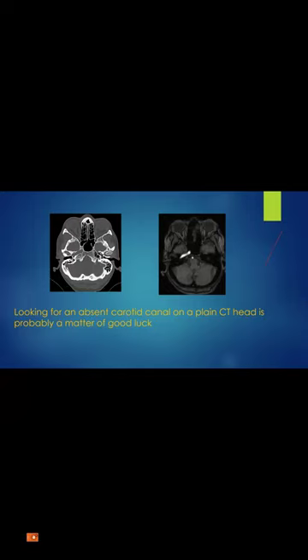We don't pay attention to every single structure. If you have a big list, 70 cases looking for strokes or traumas, or you are in a big hospital having tons of normal cases, and the patient is not complaining of anything but trauma, you didn't see bleed, you didn't see fracture. Let go. But yeah, it's an easy to miss finding.